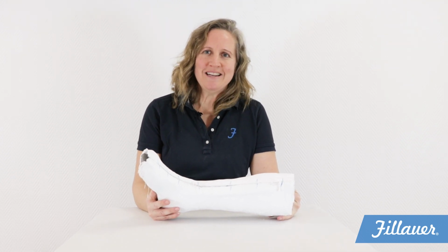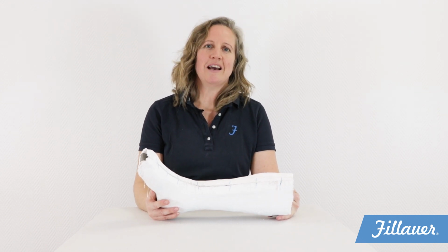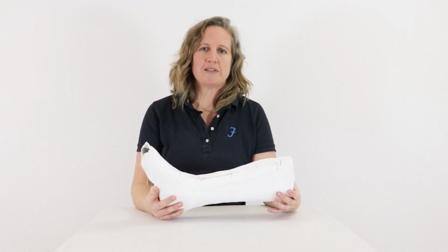Now you have what you need to complete the order. Send us the completed order form, the cast, and if you have one, a trace of the shoe insert. Make sure it's all marked with the patient reference you have put on the form. This is important to avoid mix-ups as we do receive many orders.